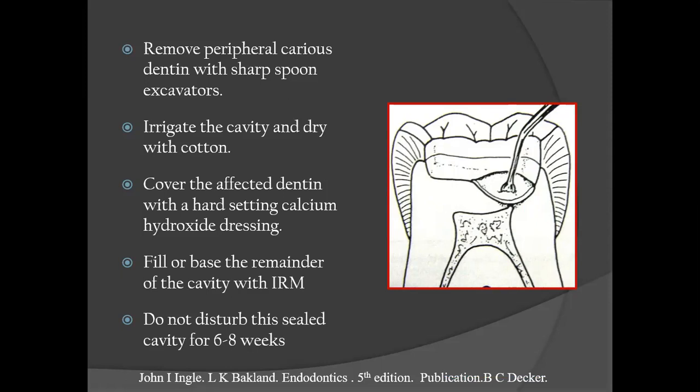Then cover the affected dentine with a hard setting calcium hydroxide cement. In conservative dentistry you would have placed a sub base, right? Calcium hydroxide sub base, zinc phosphate base, same thing. So place a hard setting calcium hydroxide on top of the affected dentine. Then fill or base the remaining part of the cavity with the intermediate restorative material. Then do not disturb the sealed cavity for 6 weeks, because 6 weeks is required for the formation of tertiary or secondary dentine, or in short, the formation of dentinal bridges. So don't disturb it, just let it be there.